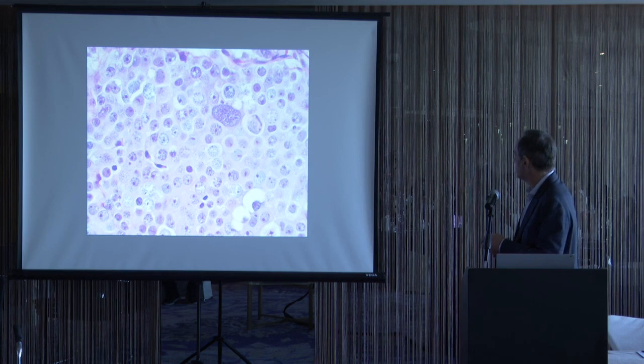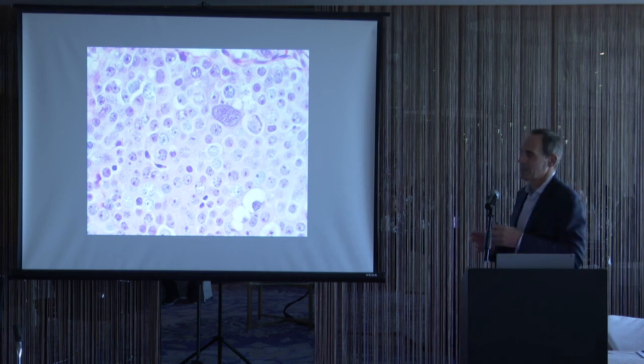Least common are giant cells. In some cases, you may not see those giant cells. And then the third pattern is, to me, something that looks like an erythroblast. Their nuclei are almost like lymphocytes, but they still have this rim of pink cytoplasm. Whereas seminomas are a more uniform population of cells with vesicular nuclei and central nucleoli, here we have these 3 cell types. Seminomas have clear cytoplasm full of glycogen. Spermatocytic tumor has this dense eosinophilic cytoplasm, another differentiating feature.